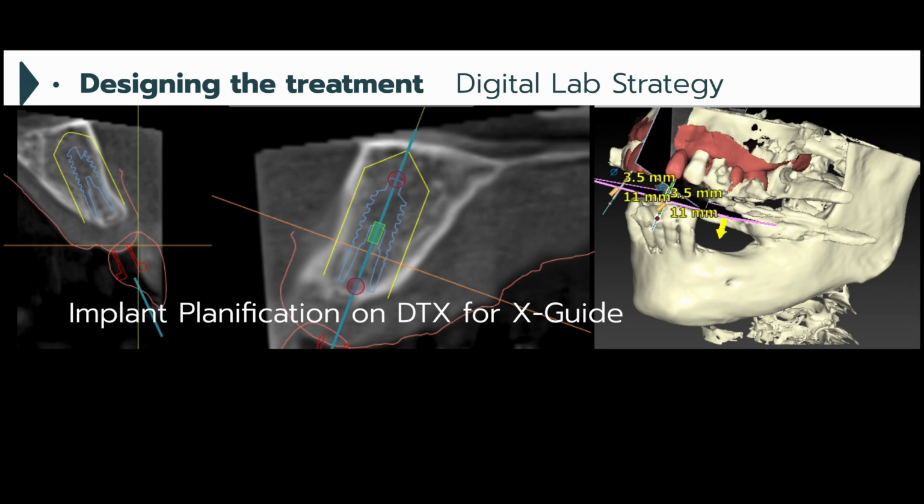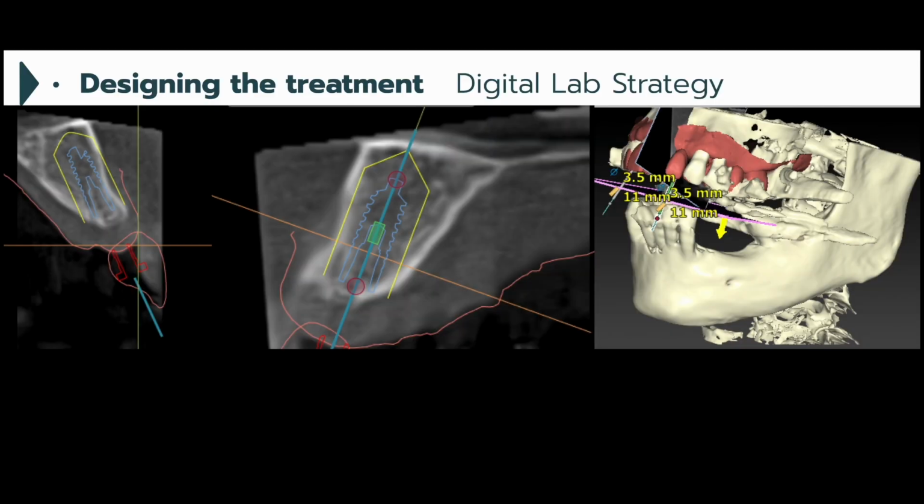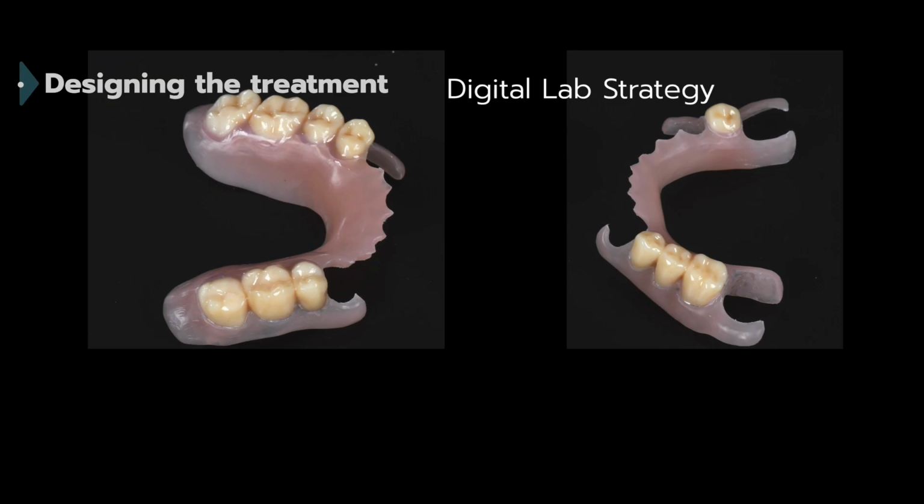Yes, in case of extraction implantation, we always use digital surgery, which could be guided surgery or navigated surgery, it doesn't matter, in order to place the two implants in the right way in this case, thanks to the first design. And of course, there are a lot of problems if we place them outside the box. In the same way, because we will transform the mouth in just one appointment, we will put the implants and we will ask the lab to build the removable temporary posterior prostheses.